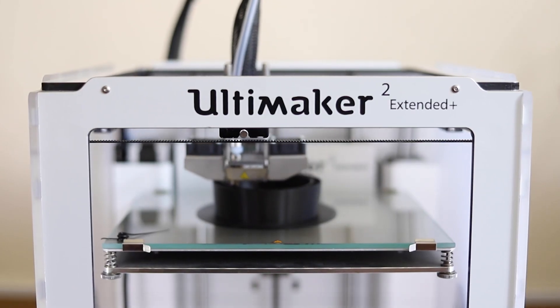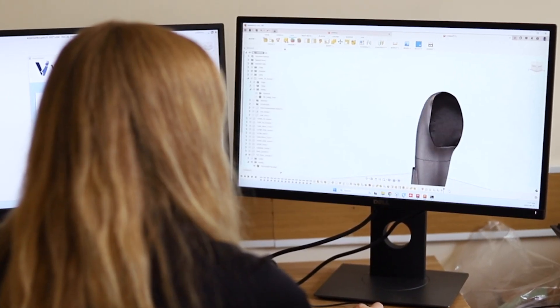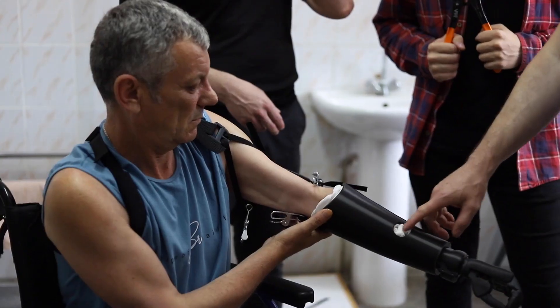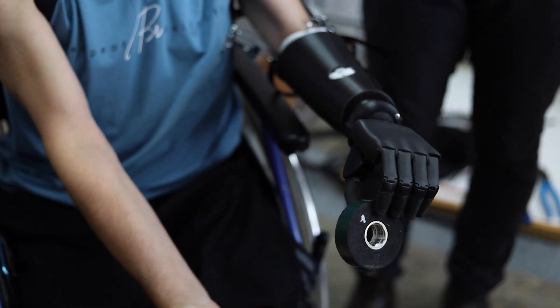The prosthetics are printed only on Ultimaker printers. However, there are some components like the laser-cut parts on the inside that are cut from steel. 3D printing is a very useful tool that can help with the current tools of prosthetics, especially for sockets for upper limbs, because they're lightweight and they can be printed customizable for each person.